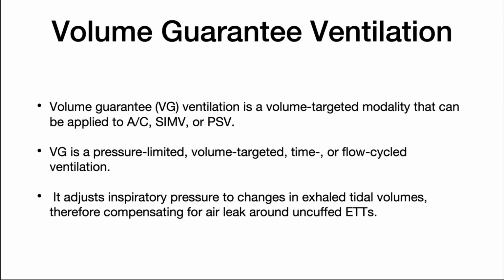Again, volume guarantee ventilation probably isn't really available to us in the pre-hospital environment, but it is something you may see during your rounds in ICU or ED.